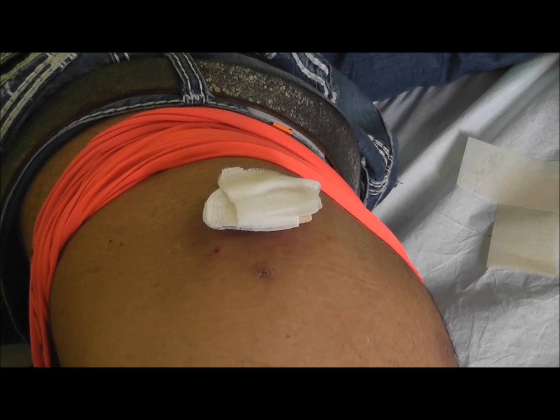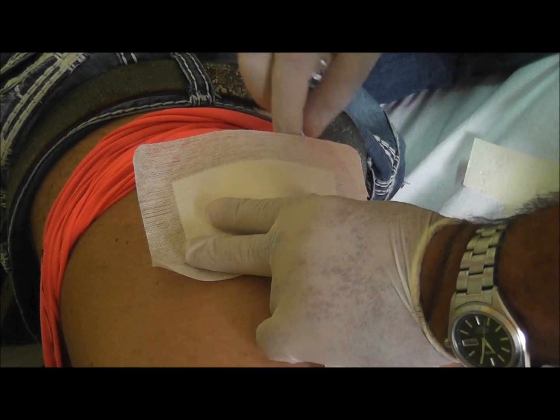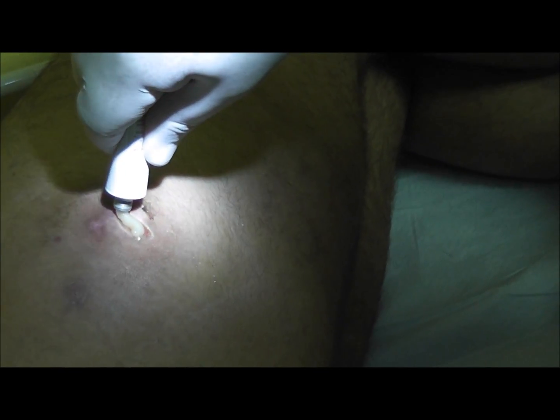What we put on top is just the dressing to keep it in place. This is day five of starting to treat that wound. You can see the difference — it's massive with the use of the elmezotran gel. And the wound now is very, very shallow. We need very little product in contrast with the first few days.